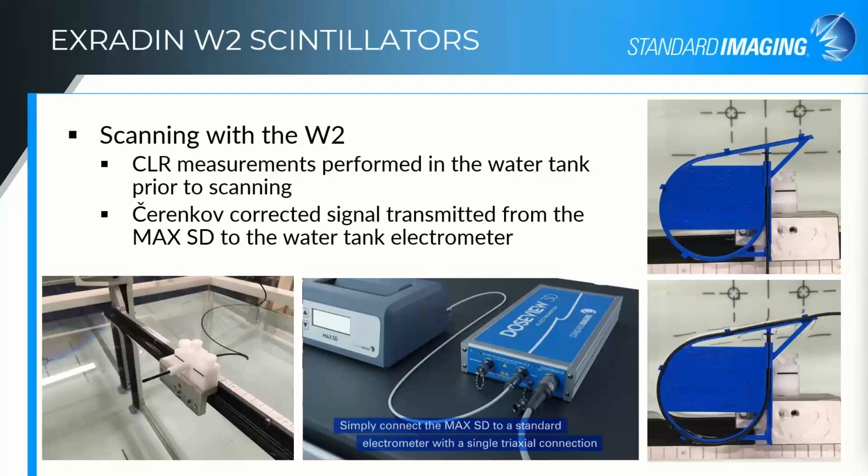Is there a limitation to the dose rate for the plastic and the W2? There are some investigations underway right now on some of that. I will say that this device was designed in the pre-flash era, and so the electronics were designed for handling very small signals, and extremely high doses create higher signals, and therefore the electronics will ultimately reach a saturation point. Exactly where that is and how that's defined and how we're going to handle that, keep your eyes on the scientific publications. We'll try and have something out that I can talk about before too long.